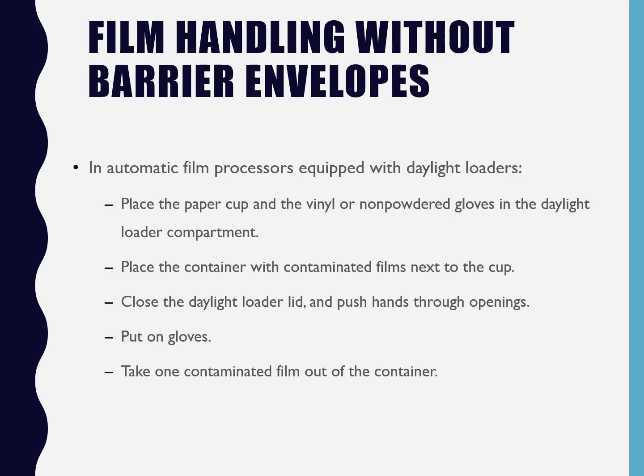Okay, so the way that we should do this if we're working in private practice, you would wipe all of your films off and disinfect them, but they're contaminated, and so you put that cup inside the daylight loader. You're going to want another cup inside the daylight loader as well, where you put your film, or you can have maybe a flat surface where you would drop the film onto, because you don't want to touch the film with your contaminated gloves while you're opening films. And then you place either a cavi wipe of some kind in there.